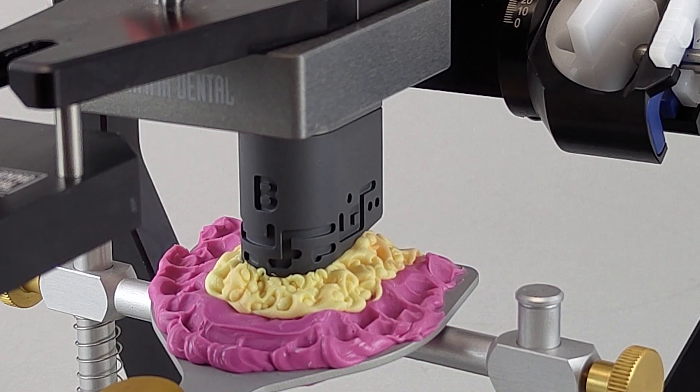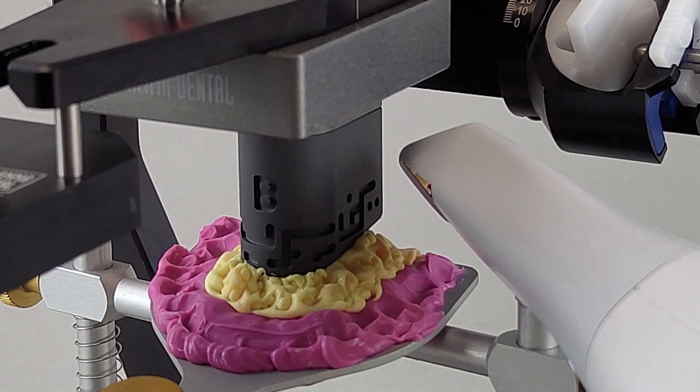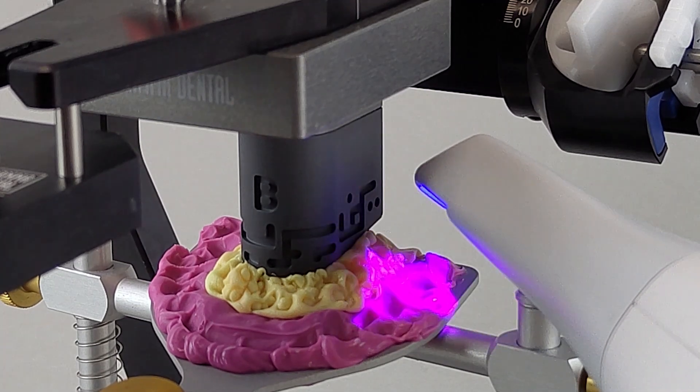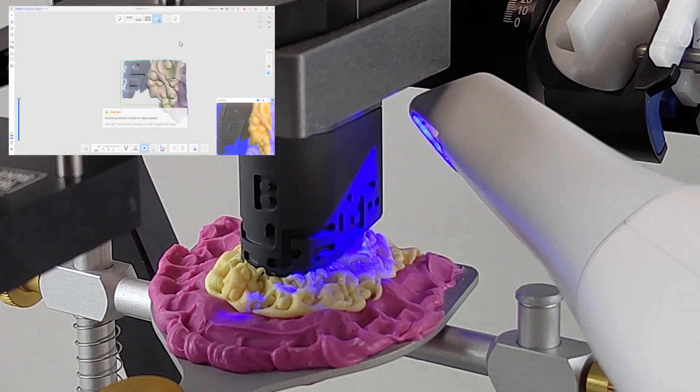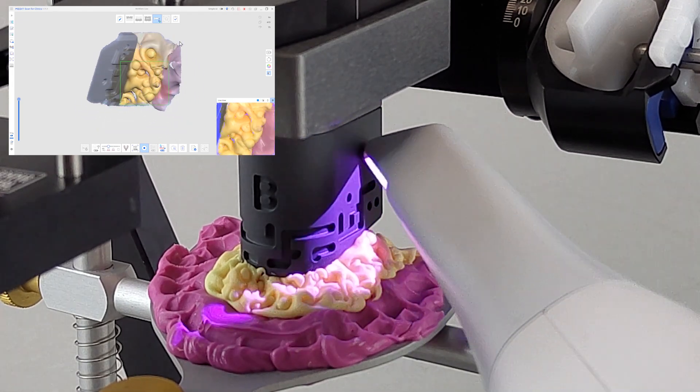The intraoral scanner is then used to scan the upper jaw impressions together with the reference pattern of the digital transfer block. This will subsequently allow the intraoral scans to be brought into the articulator coordinate system as well.